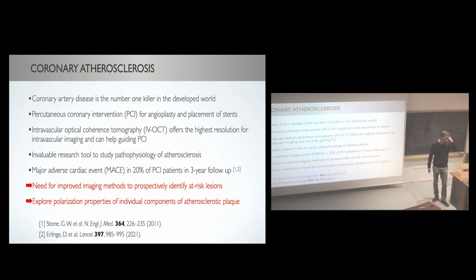Intravascular OCT is increasingly used to guide these procedures, and has also become an invaluable research tool to study the pathophysiology. Unlike other diseases, you can't biopsy the coronary artery in a living patient, for obvious reasons. So the only way to gain insight is by doing in vivo imaging. And there's this conundrum that a lot of patients who undergo a PCI procedure, or 1 in 5 patients, within a few years usually return with another event.